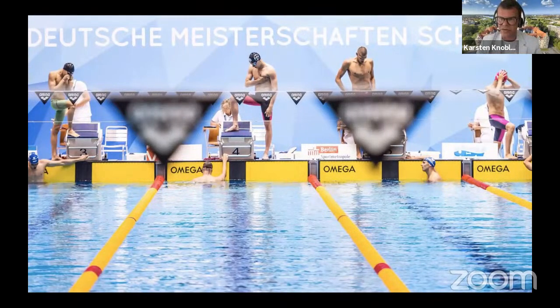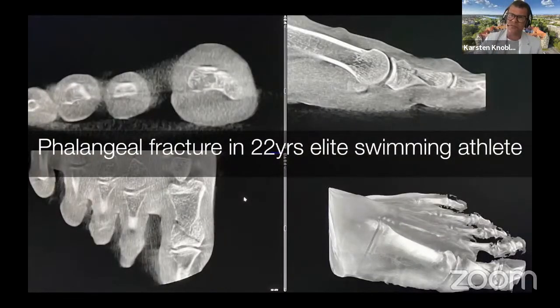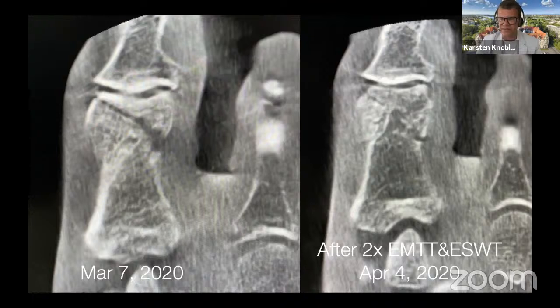This is a national swimming athlete competing for the Tokyo Olympic Games, suffering this great toe fracture, as you see. Not a big surgical problem; however, it withheld him from training for the Olympics. So he came 600 kilometers from Munich to Hanover to undergo focused shockwave and EMTT treatment, for 2 sessions only because of the long distance drive. This is him before, with the cone beam weight-bearing CT scan, shockwaves, EMTT, 2 sessions, and you see 4 weeks later, between March 7 and April 4th, not a complete consolidation. However, clinically, he was pain-free after 3 weeks, so he could train again in the Olympic pool.